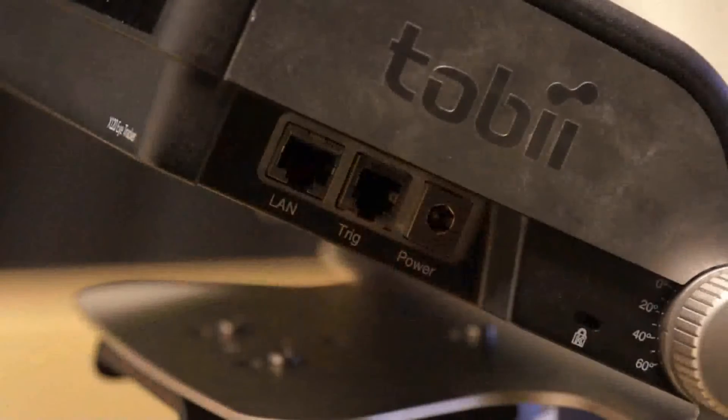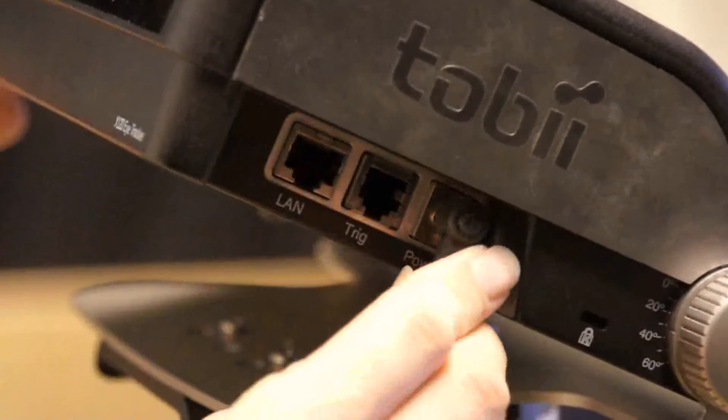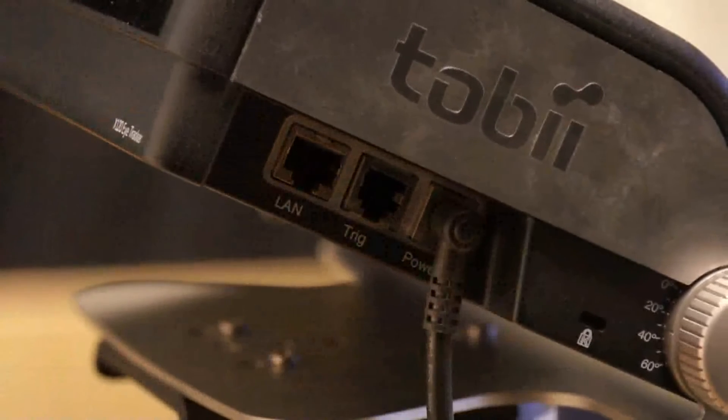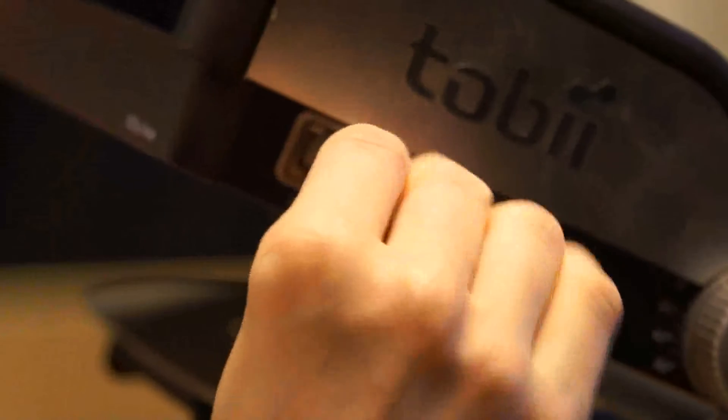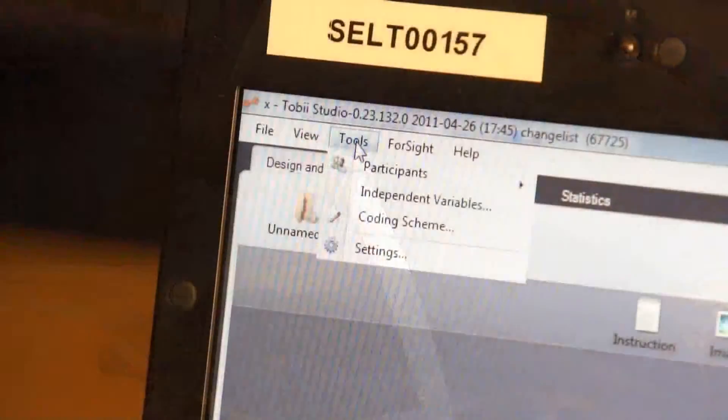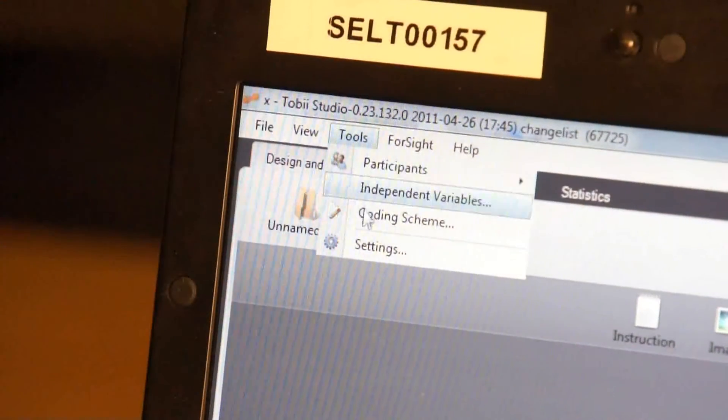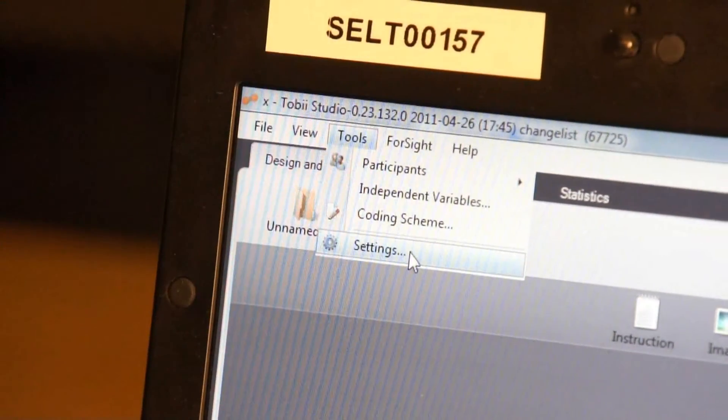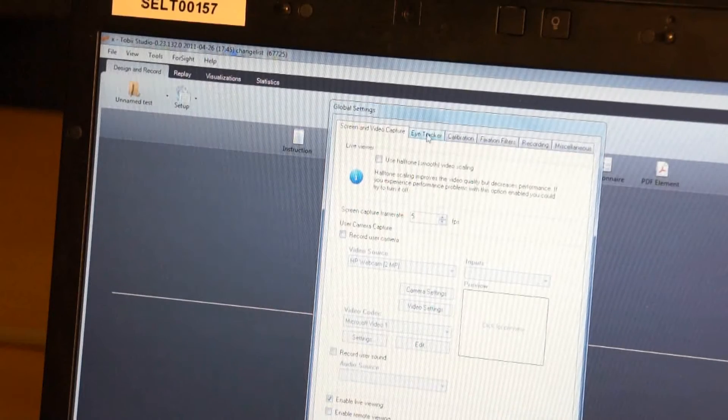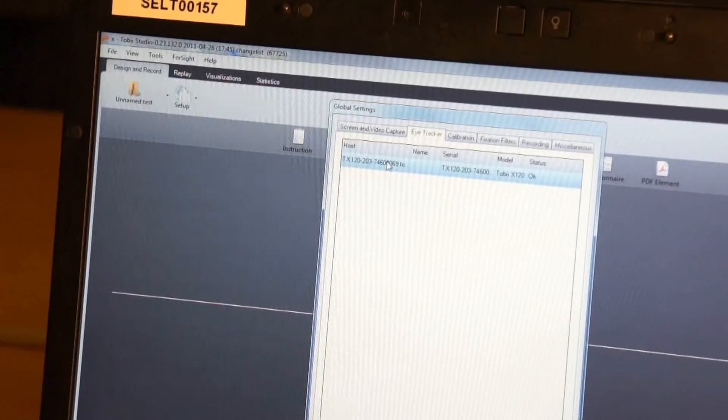Connect the eye tracker to a power source using the supplied power cable. Connect the eye tracker via a LAN cable with the computer running Tobii Studio. Select Settings and click on the Eye Tracker tab. Select the eye tracker to be used and click OK.